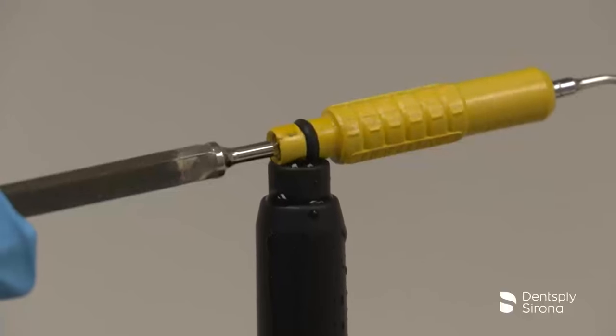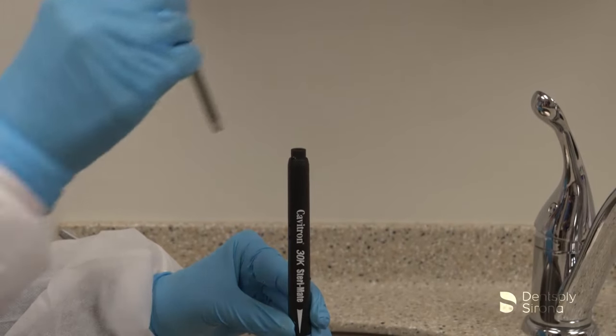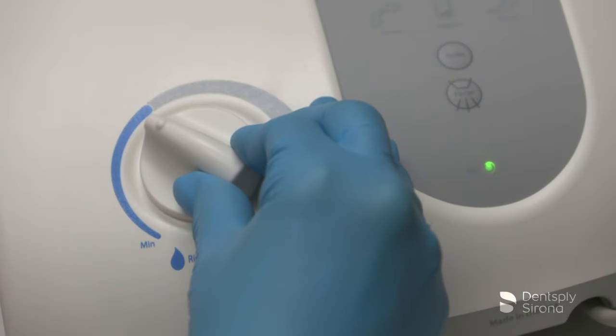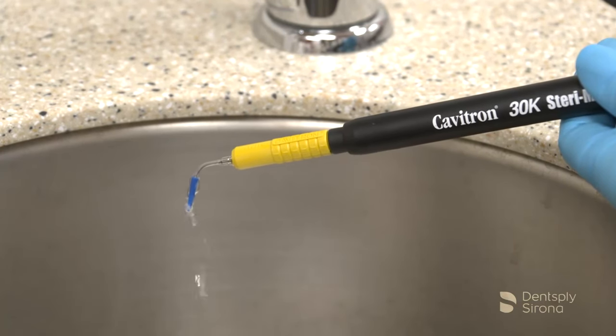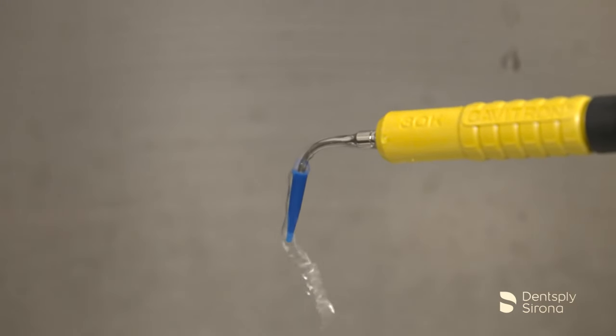After the clinician has placed the Soft Tip Disposable Profi-Tip with the wrench included, filled the handpiece with water, seated the insert, selected the power, and adjusted the water flow to obtain a fine spray, instrumentation begins according to the treatment plan prescribed for the patient.